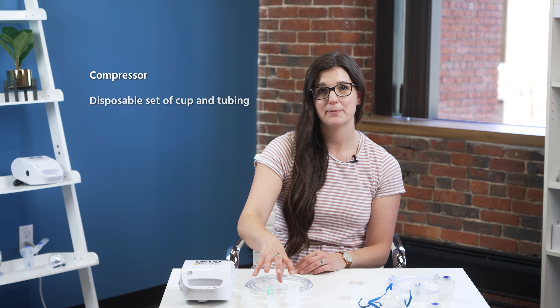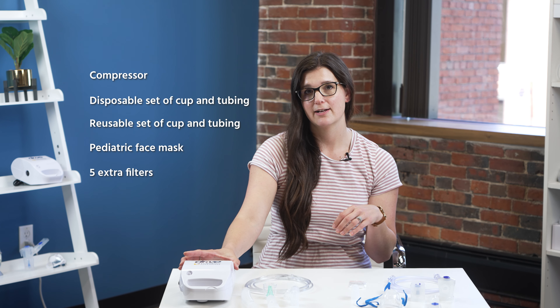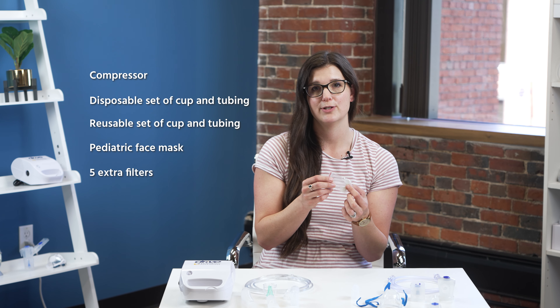Each DRIVE kit comes with a compressor itself, a disposable set of cup and tubing, a reusable set of cup and tubing, as well as a pediatric face mask. The compressor itself has a filter in there already, but they also give you five extra filters for use as needed.